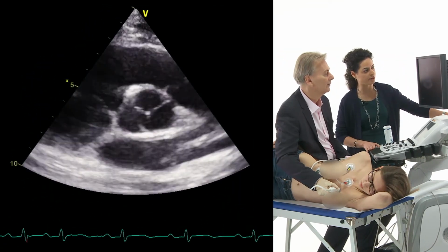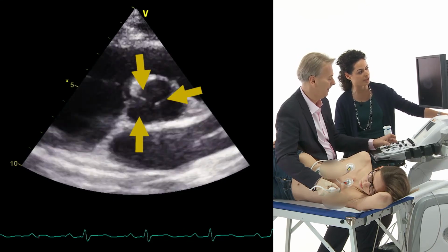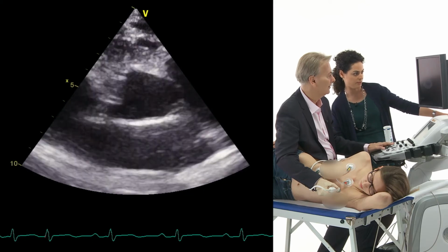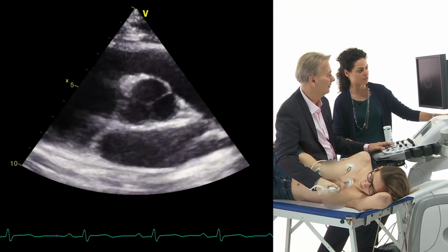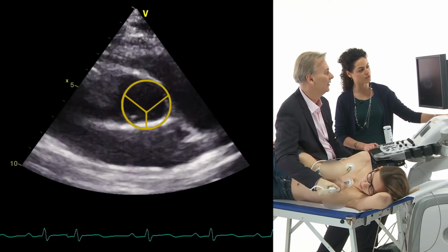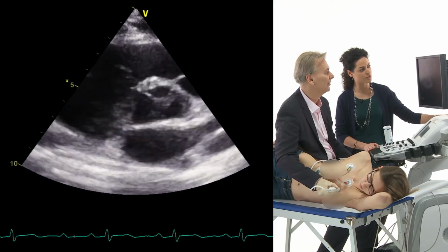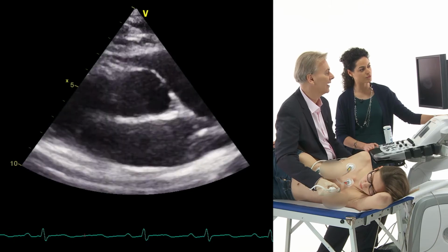This is great. We actually can see the three cusps opening and a really nice tricuspid aortic valve. Yes, you see the three cusps. And we usually say they look like the Mercedes star. This is how we check whether or not the valve is really imaged the way it should be. Some also say it's the peace sign.